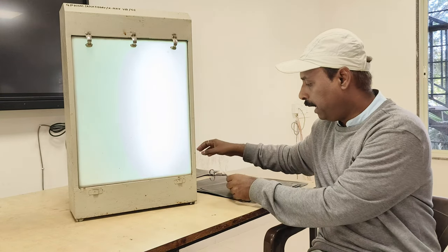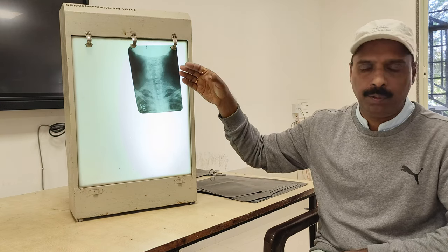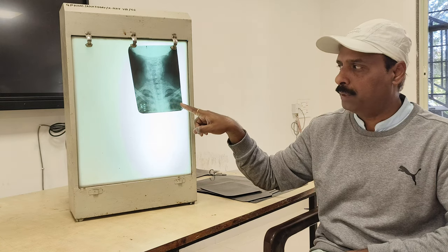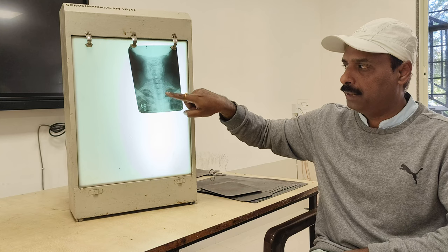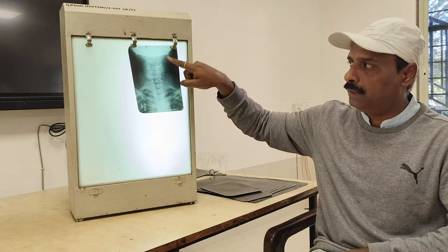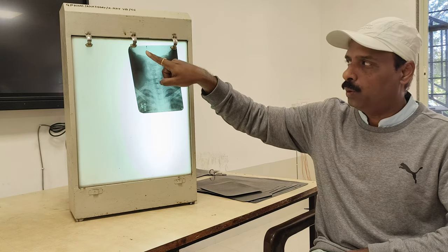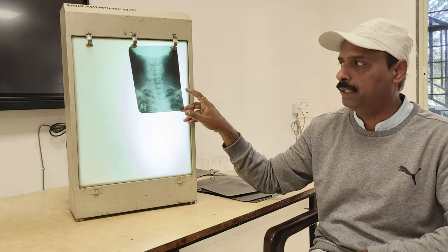Next, going to the other plain variety, we have the spine, that is the cervical spine, where we get the AP view, in which the lower part of the skull is there, then the cervical spine and the upper part of the thoracic cage. You can see the upper part of the thoracic cage showing the ribs, and here we have the cervical vertebrae. For identification of the cervical vertebrae, you get all the spines, and the clavicle also. Then we get the base of the brain, the skull bone, that is the occipital bone. So we have the occipital bone of the skull, the cervical vertebrae and upper part of the thoracic vertebrae, and the clavicle and ribs. So this is an AP view of the cervical region, the neck region. That is what you have to comment on when you get this type of x-ray.